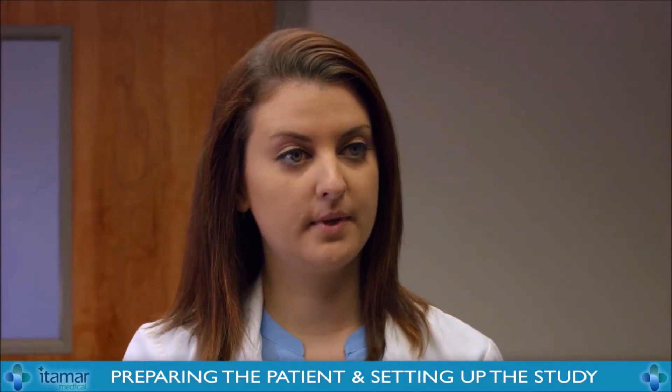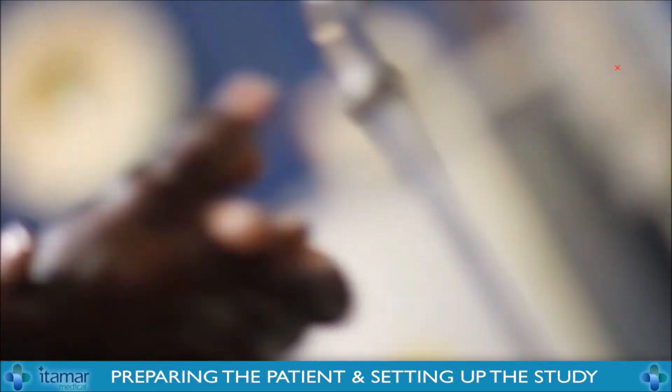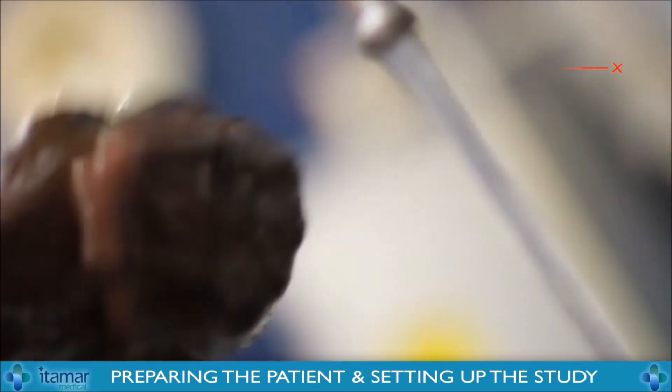Hello, my name is Megan. I'll be performing your EndoPAT test today. The test is going to be 20 minutes long, so if you need to use the restroom, now would be a good time. And when you wash your hands, please remember: do not use hot or warm water.